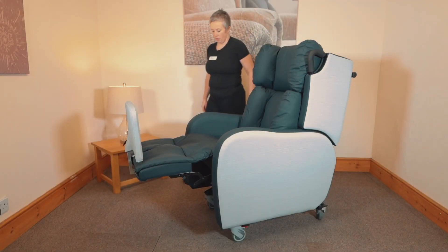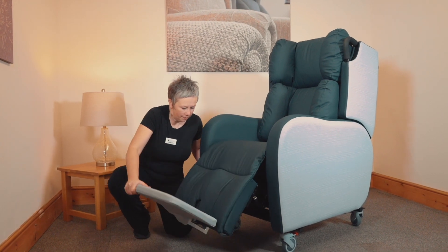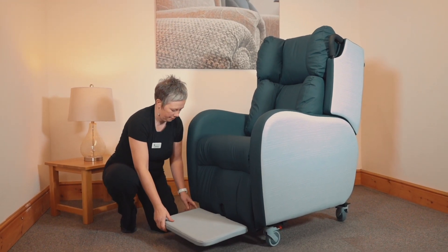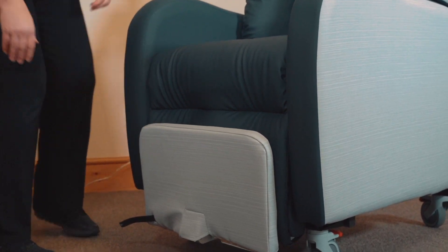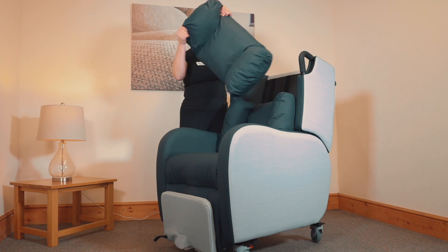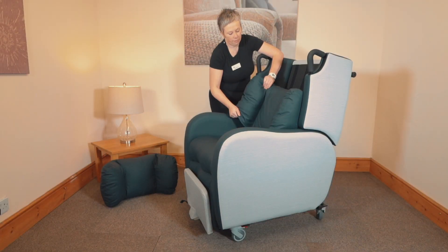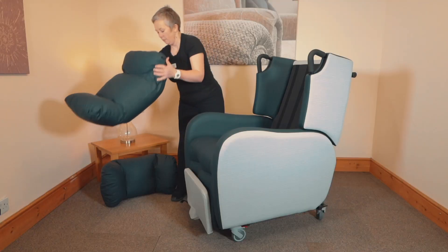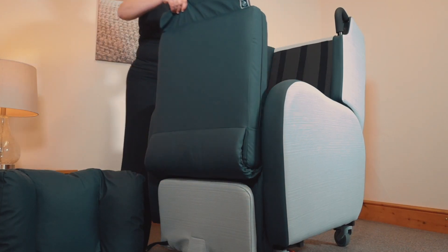The fabric is washable at 95 degrees centigrade and available in a range of colors. The covers can also easily be removed for cleaning. All the cushions are removable and interchangeable, allowing it to be adapted over time.